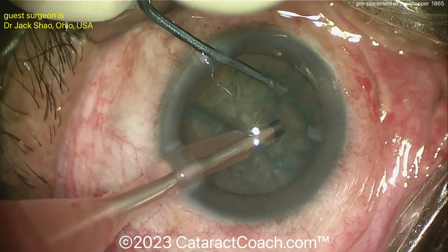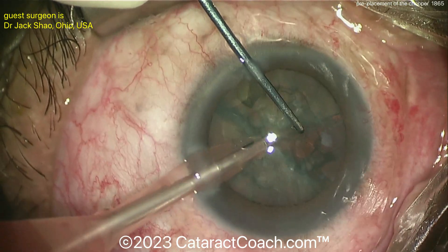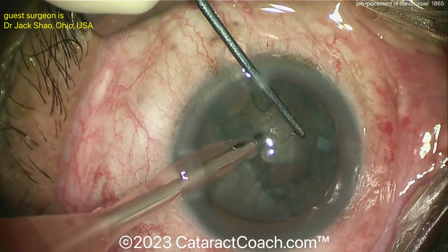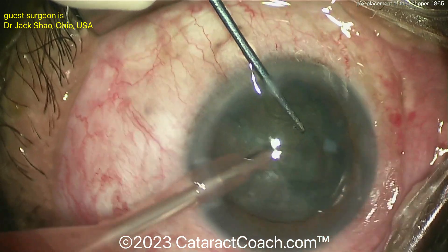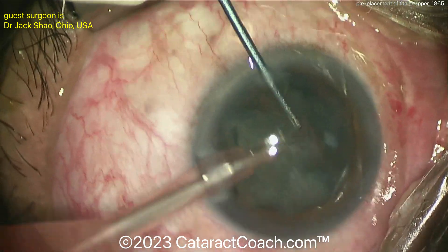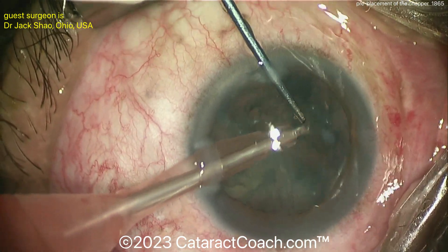In this technique, the chopper is pre-placed around the lens equator. By pre-placing it around the lens equator, you're able to take your time in engaging the nucleus with the FACO probe. Then when you engage the nucleus, just step on the pedal, get a little bit of energy, and then hold it with the vacuum and complete the chop.